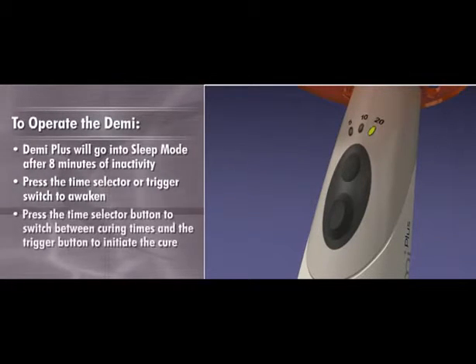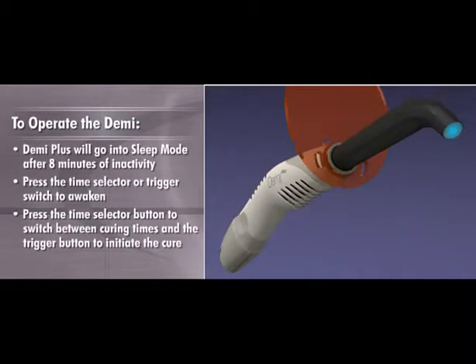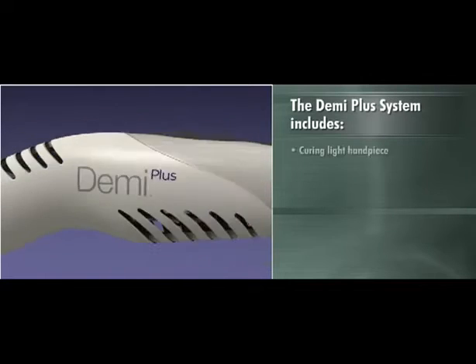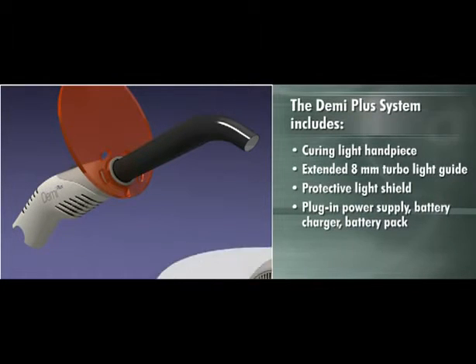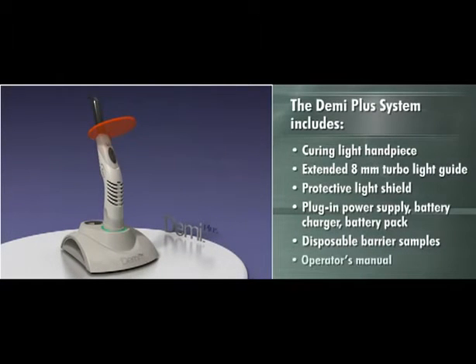Press the time selector button to switch between curing times and the trigger button to initiate the cure. Demi Plus comes complete with a curing light handpiece, extended 8-millimeter turbo light guide, protective light shield, plug-in power supply, battery charger, battery pack, disposable barrier, and operator's manual.